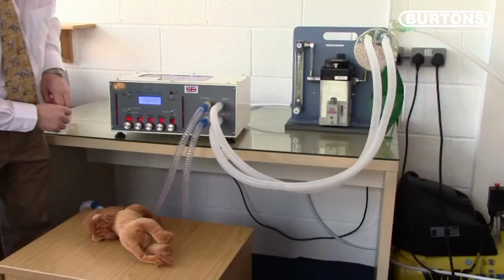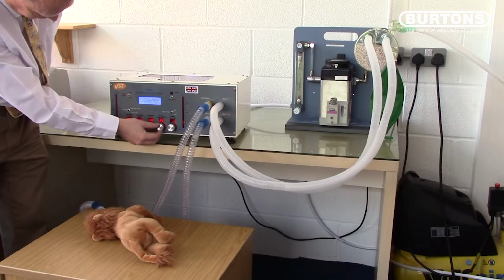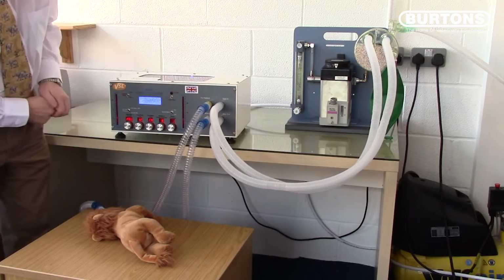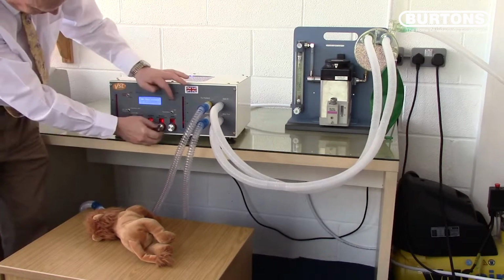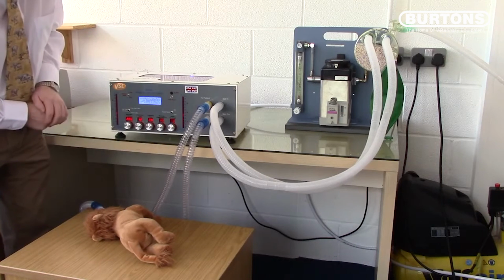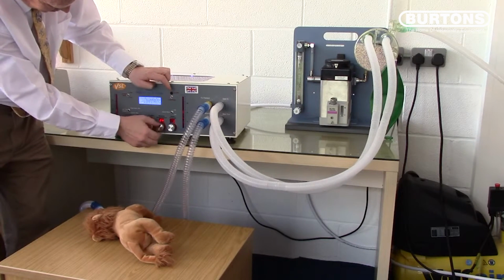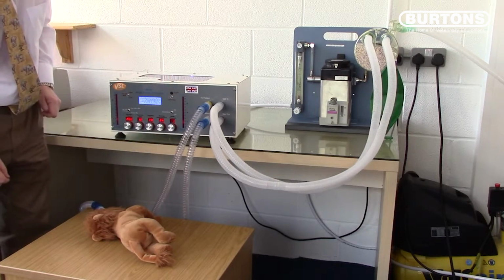Although covered in another video, just briefly look at the effect of reducing the maximum working pressure limit setting. If the maximum working pressure limit is reduced using the knob, the pressure in the system will rise during ventilation and reach that pressure and then stop ventilation, and you'll notice that the alarm goes off and the patient does not inflate as much as previously. This is a safety feature of Merlin.